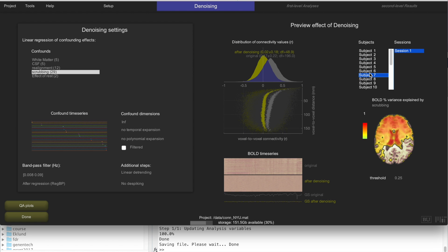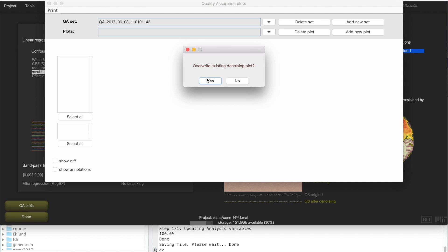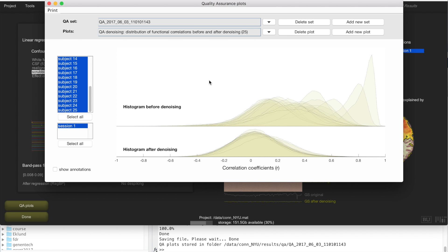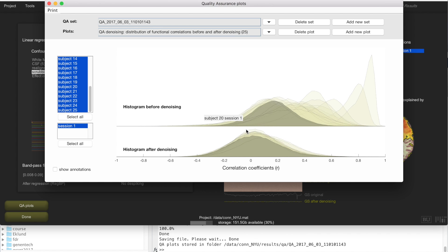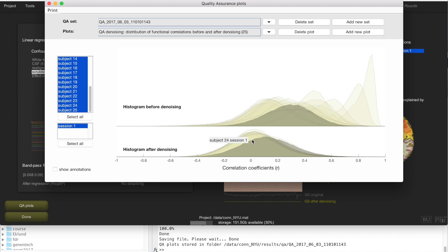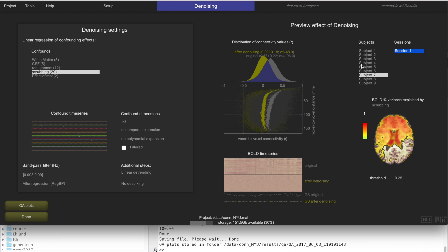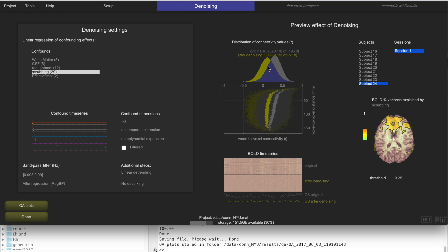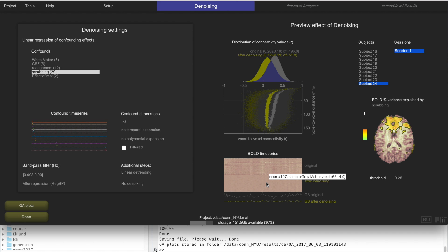You can check this across multiple subjects to see whether denoising is working as expected. Looking at the distribution of voxel-to-voxel correlations before and after denoising, you typically want distributions that are similar across all subjects and centered. We have one example here — subject 24 — that seems a little bit different from the rest, showing a slight bias towards positive values and some residual pattern in the carpet plot after denoising. So we might want to address that.